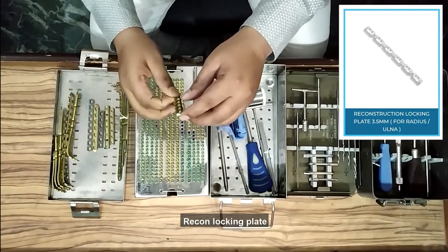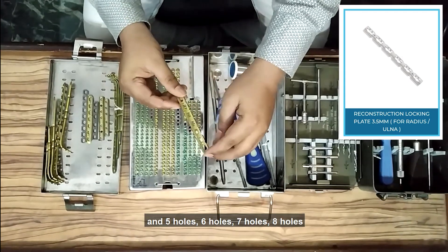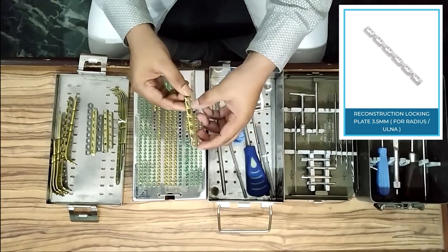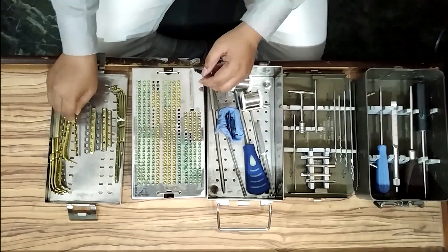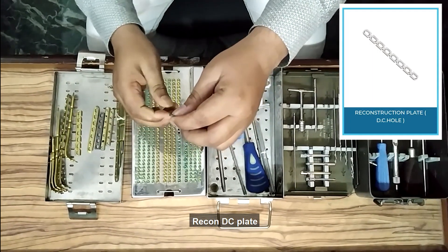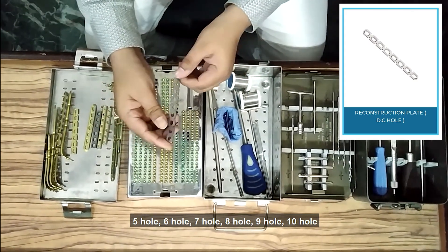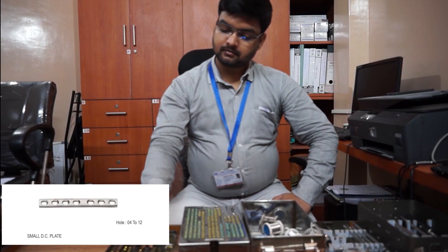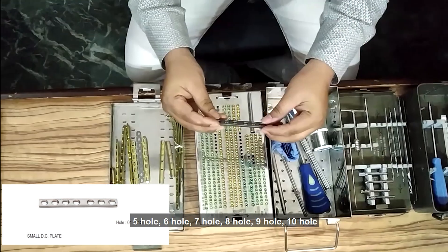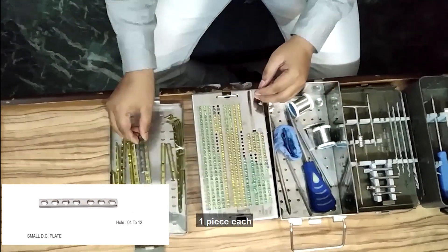Next, recon locking plate — this is a straight plate — in five-hole, six-hole, seven-hole, eight-hole, nine-hole, and ten-hole. Recon DC plate: five-hole, six-hole, seven-hole, eight-hole, nine-hole, ten-hole. Small DCP non-locking plate: five-hole, six-hole, seven-hole, eight-hole, nine-hole, ten-hole, one piece each.